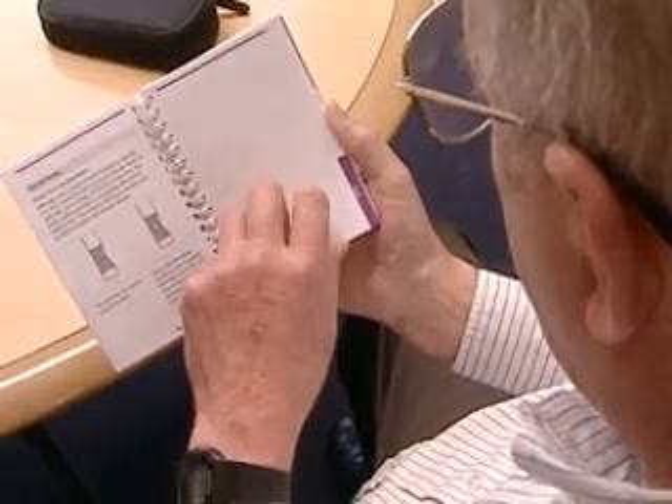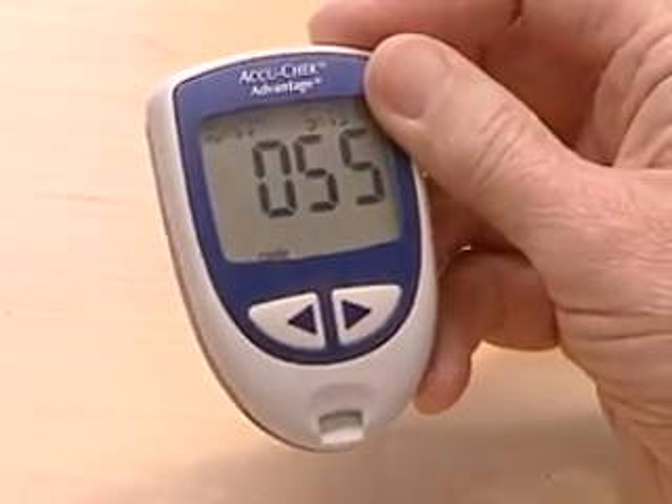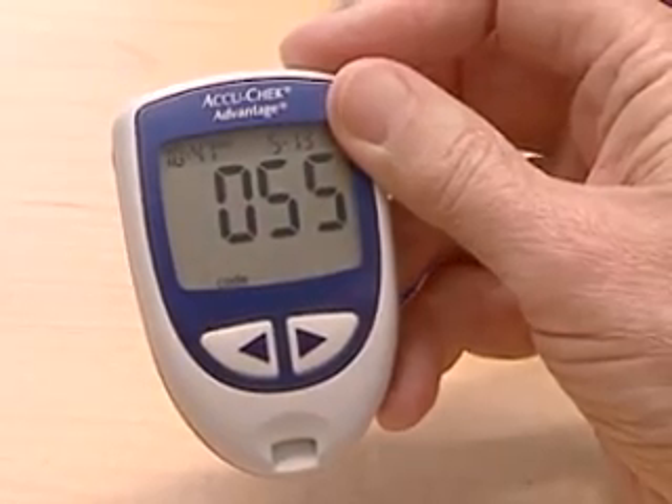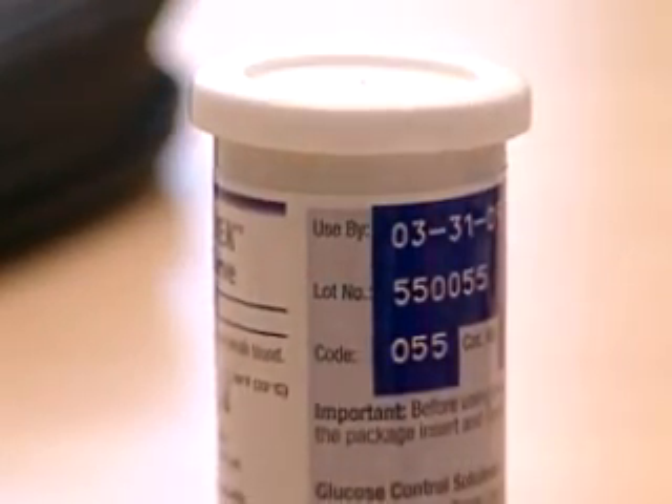First, be prepared before you do the test. Carefully read all the instructions for your meter and the test strips. Calibrate the meter or test it to be sure it's calibrated before you use it. Be sure that you're using test strips that are specified to work with your meter.